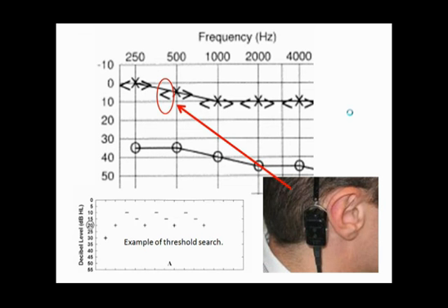So let's take this step by step. Bone conduction threshold, unmasked, for the right ear, when the bone vibrator is on the right ear. We do this protocol. Remember, the three or four ascending rounds. We look for the lowest level where we get a positive response at least 50% of the time. This test run isn't necessarily for this; it's just for illustration. But that's what we're going to do.